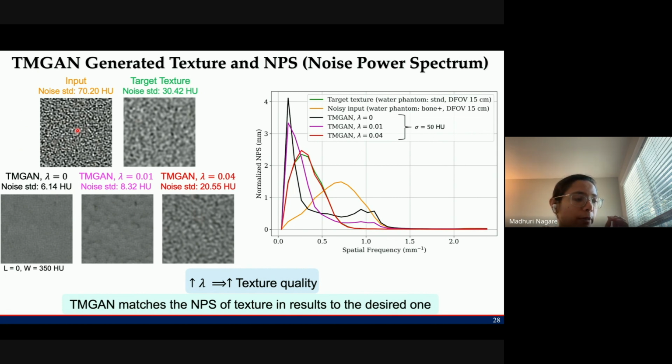To put it briefly, these reconstructions control the frequency content of your images. For example, the standard kernel is the most widely used kernel, which is just the filter back projection basic algorithm for CT reconstruction. Then there are bone kernels, which are high resolution kernels, so they preserve more detail in the images. So this input image is reconstructed with bone plus kernel.